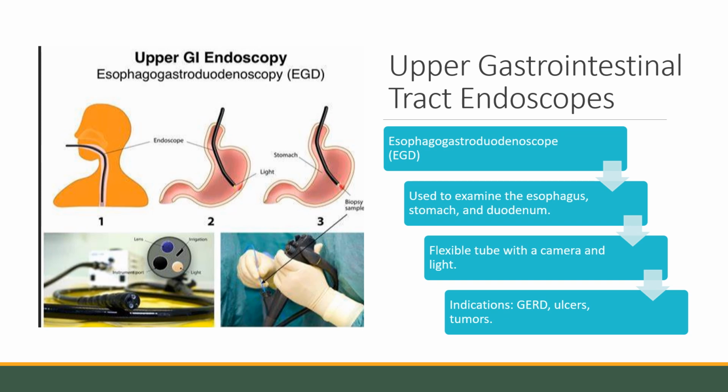GERD is referring to a reflux, gastric reflux disease. So think of the most intense heartburn you've ever had. So this procedure is for upper GI, which GI is referring to your gastro, which is your stomach in med term. Intestinal are our intestines. So this one in particular looks at the three structures, your esophagus, stomach, and duodenum.